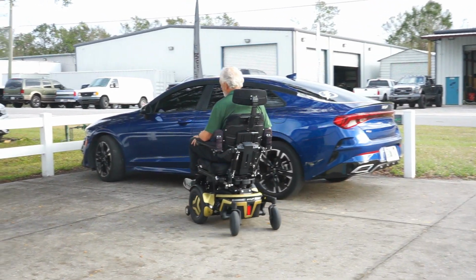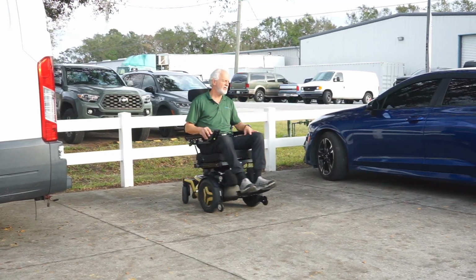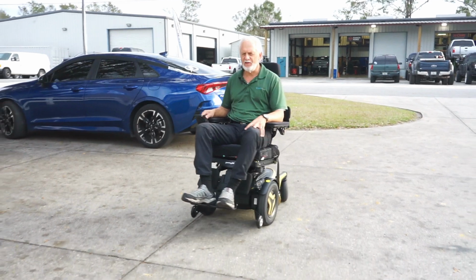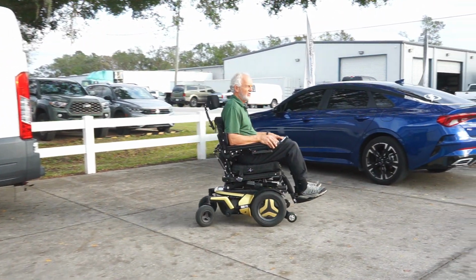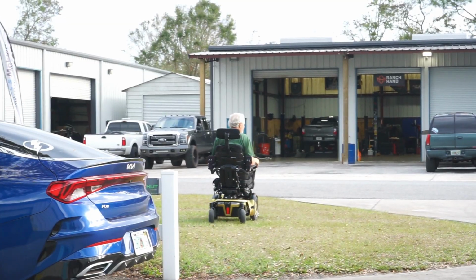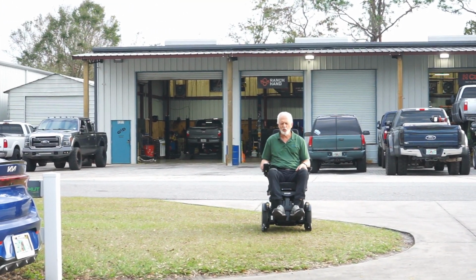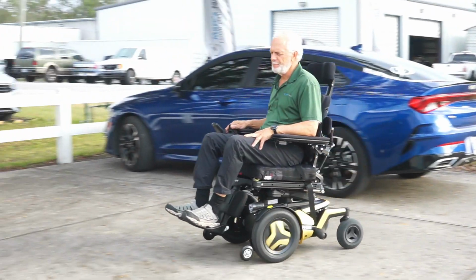These are smooth because these are the high-end chairs. They weigh 400 pounds plus. They're so smooth. When I started this 30 years ago, if I would have seen a chair like this, I would have said, oh my gosh, what is the future going to be like? And in the grass, no problem at all. This is a front wheel drive, so it does really, really well outside in the yard because all your weight is on the front wheels. There's nothing to stop you in front of those drive wheels.